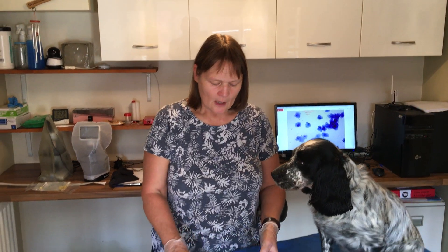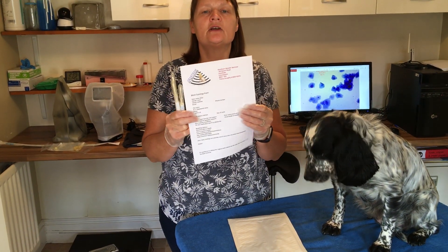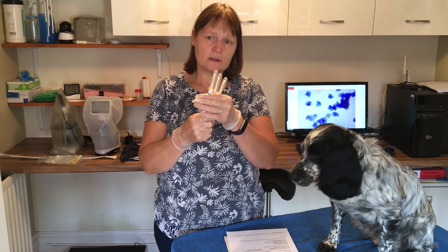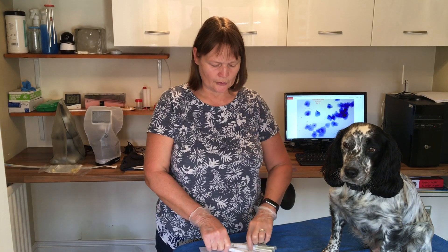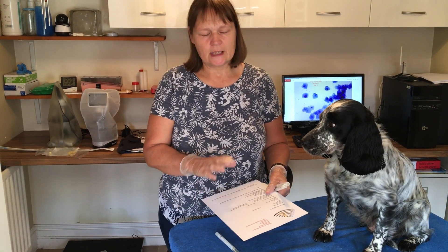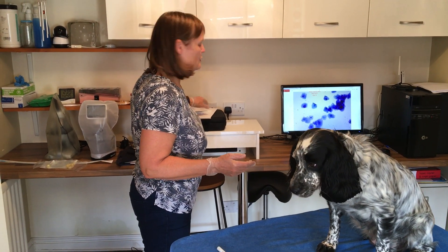We'll send you a kit, we'll send you a pack. You'll have a form which you'll need to photocopy if you're likely to need more than one sample analysing. You'll get three swabs ready to do one to three tests, gloves which I've put on already, and there'll be a biohazard bag in there which you'll get to send your return swab in.